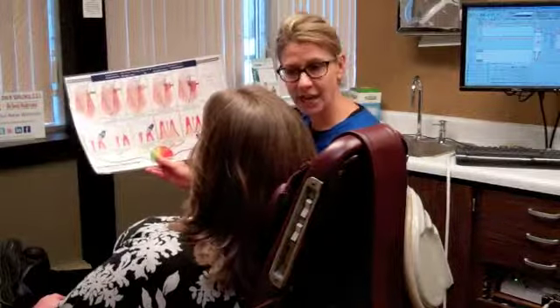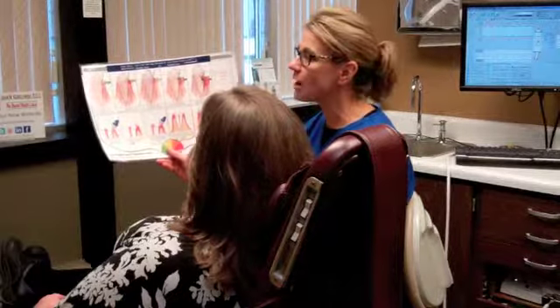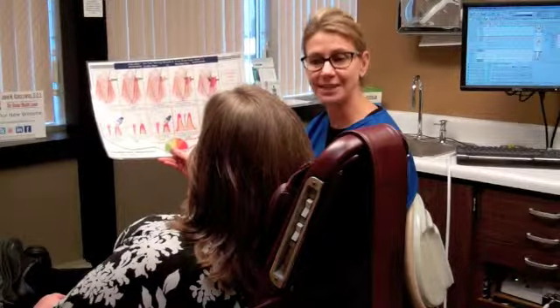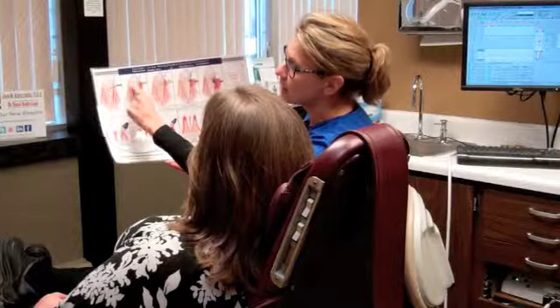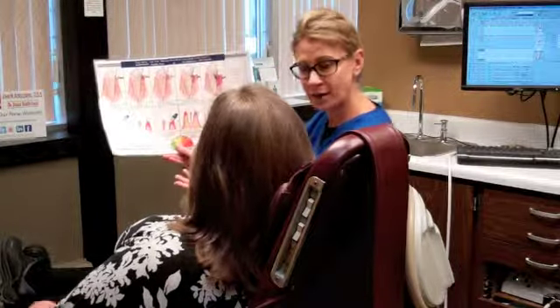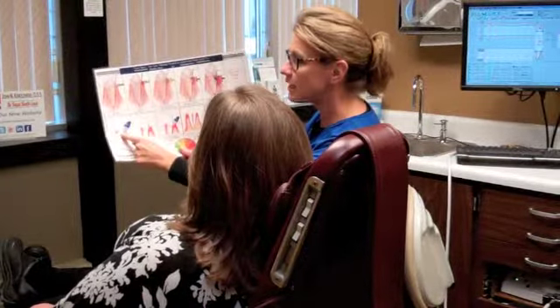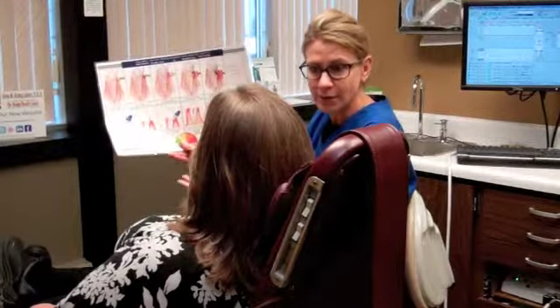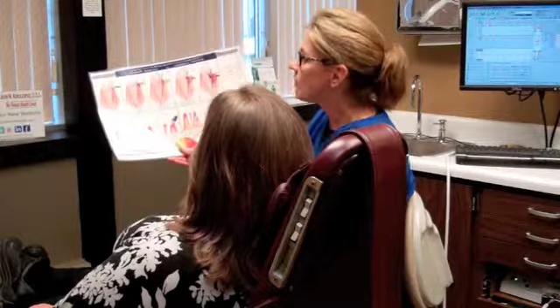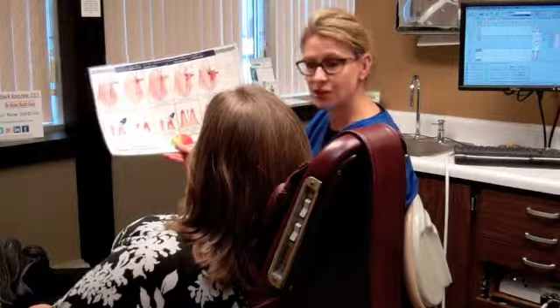Then I'm going to say a number. You have a collar around each tooth, and I'm going to measure 6 areas. If you take a look here, 1 to 3 is healthy. Why is 1 to 3 healthy? Because you can get your brush and your floss down into that pocket depth and clean all the plaque out of those areas. 4 millimeters is gingivitis.